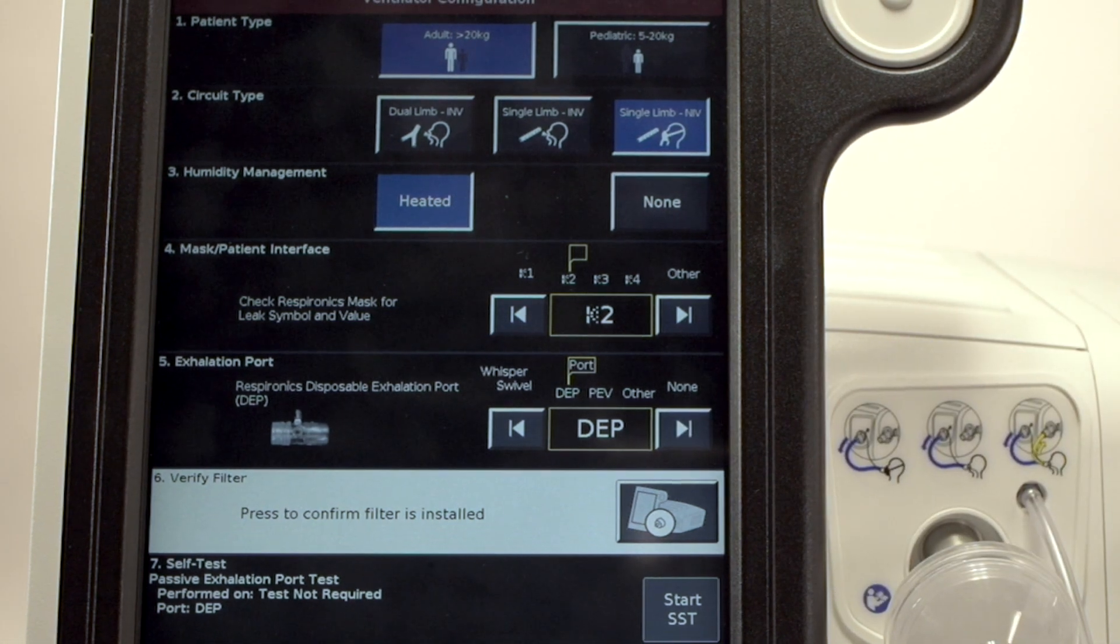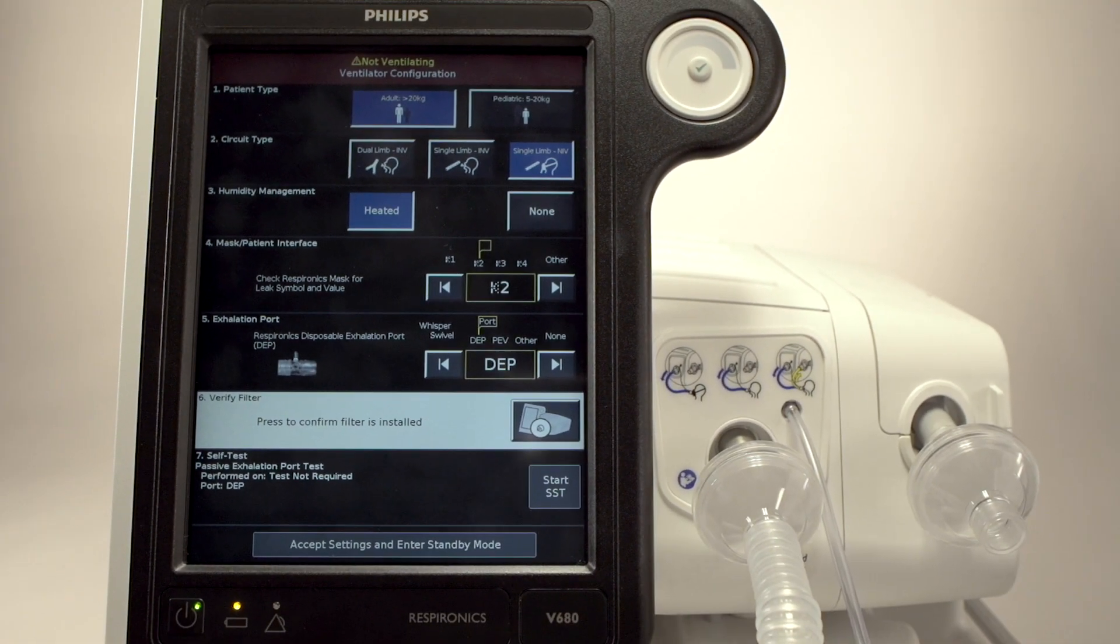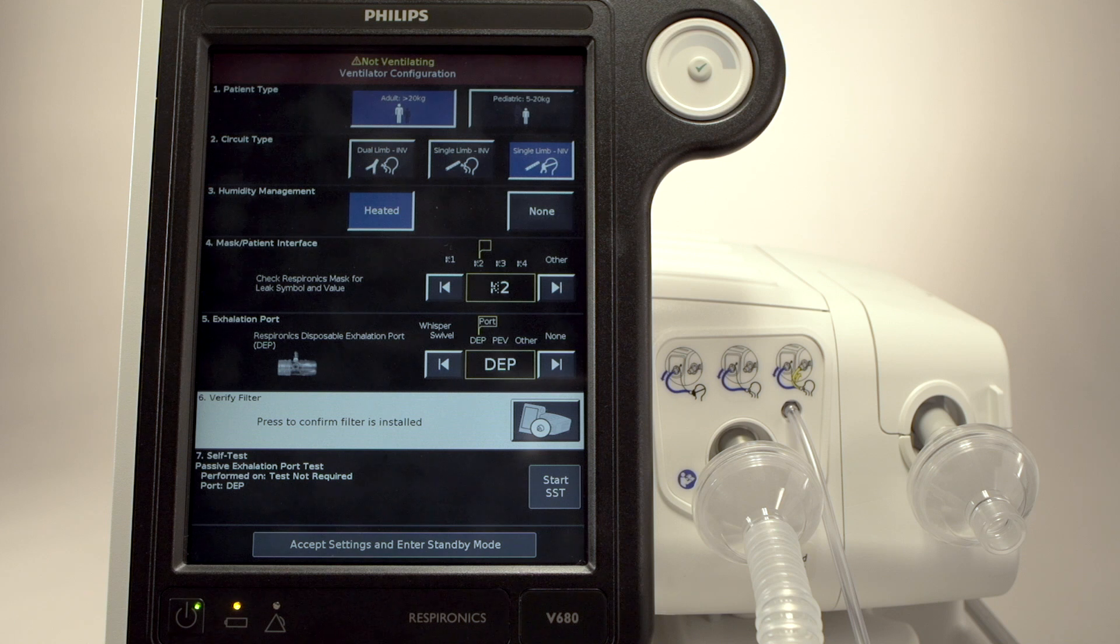Confirm you have filters installed and touch the Start SST button if you are using a mask and circuit other than one from Philips Respironics. If you are using a Philips Respironics mask and DEP circuit, you can skip the SST if you don't need to check the function of a remote alarm.